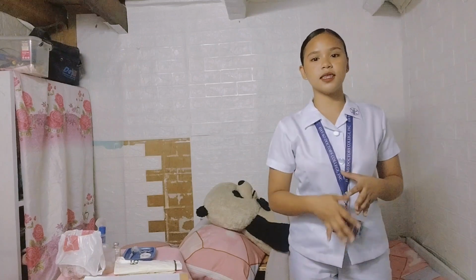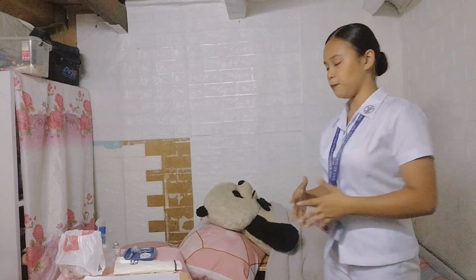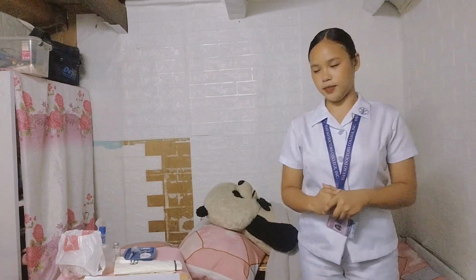Okay, now let's select and clean the site of the patient. Select the site that is free from tenderness, hardness, swelling, scarring, itching, burning, or localized inflammation, or select a site that has not been used frequently. Before proceeding to the procedure, let us first apply clean gloves.